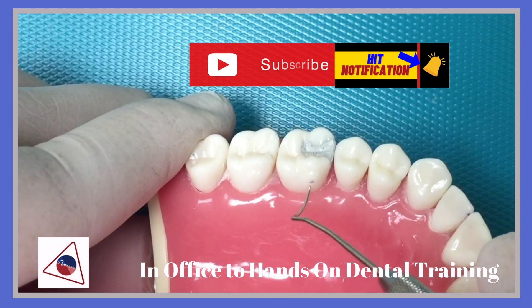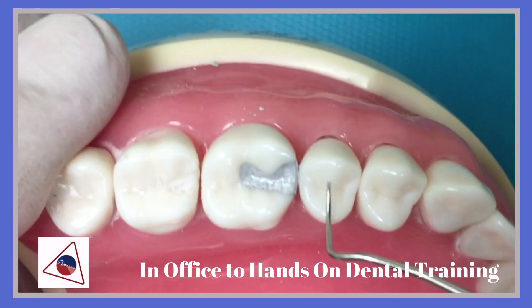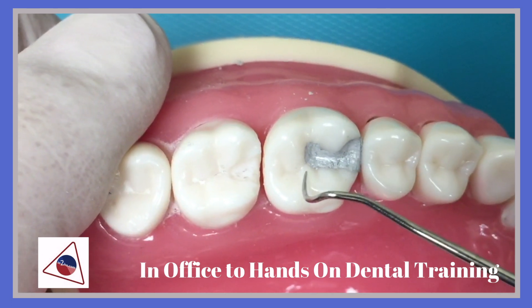Continue to check your restoration for excess amalgam and checking the embrasures.